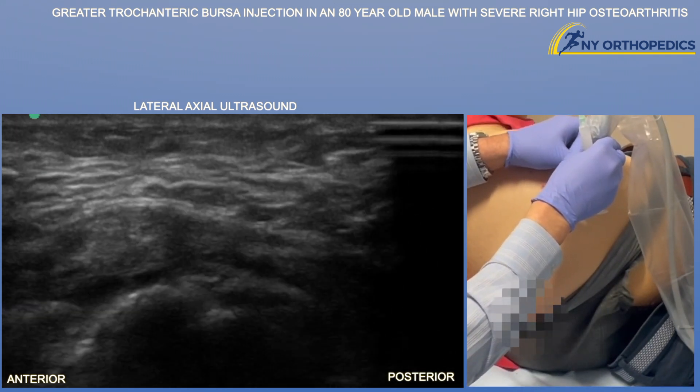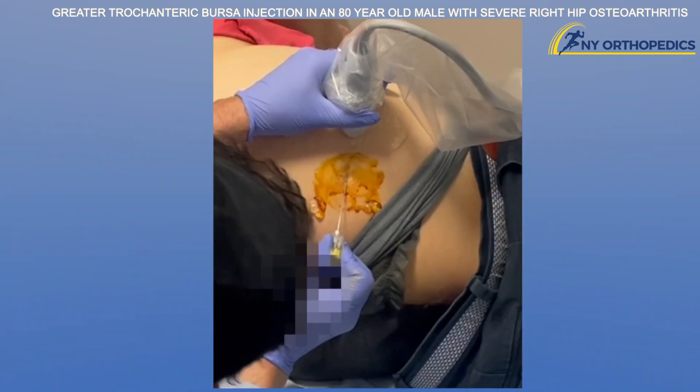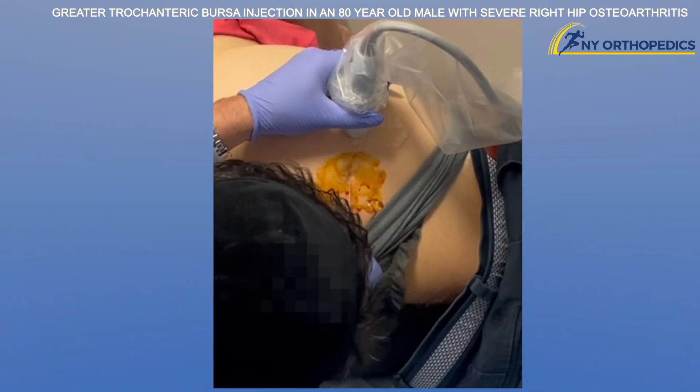Now we're going back towards the apex of the greater trochanter. The iliotibial band seems a little bit thickened here in this patient. And now we're starting with our injection.